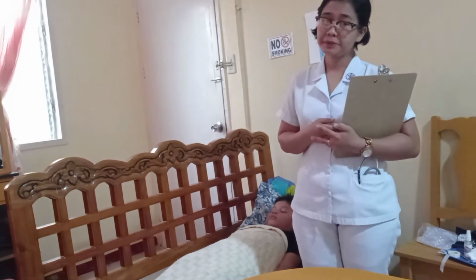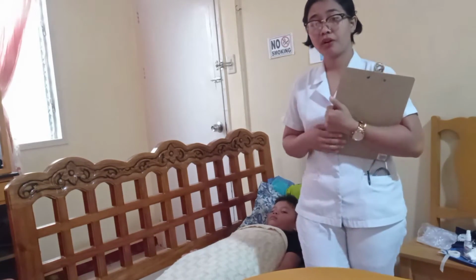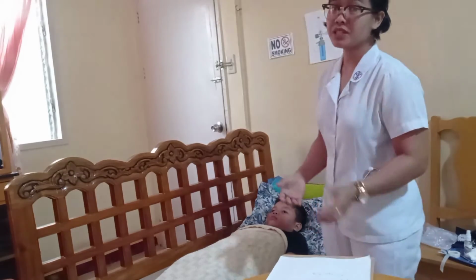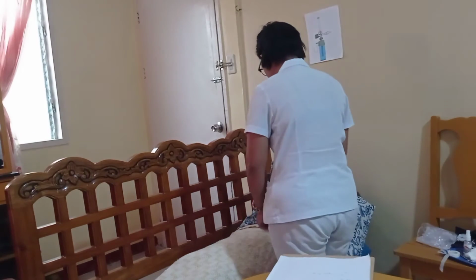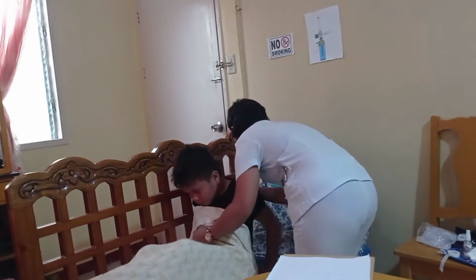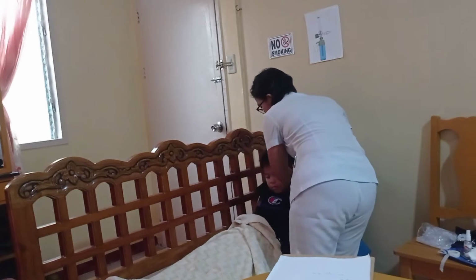Then, in preparing the client and support people, first I am going to assist my client to a semi-Fowler's position if possible, and the rationale for this is the position promotes chest expansion with the least amount of effort. So sir, I will just move you to a semi-Fowler's position so you have a comfortable position during the oxygen therapy.